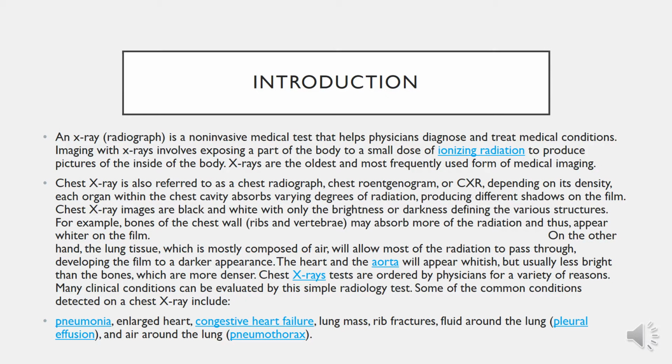Introduction. An X-ray radiograph is a non-invasive medical test that helps physicians diagnose and treat medical conditions. Imaging with X-rays involves exposing a part of the body to a small dose of ionizing radiation to produce pictures of the inside of the body. X-rays are the oldest and most frequently used form of medical imaging. Chest X-ray is also referred to as a chest radiograph, chest röntgenogram, or CXR.